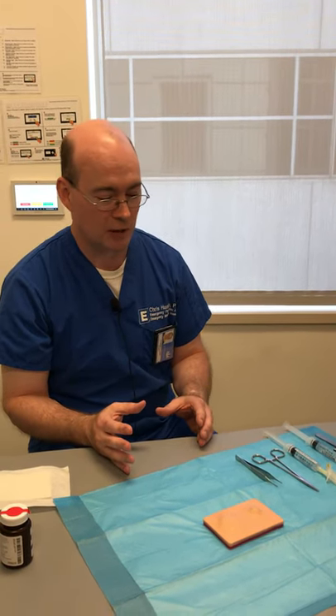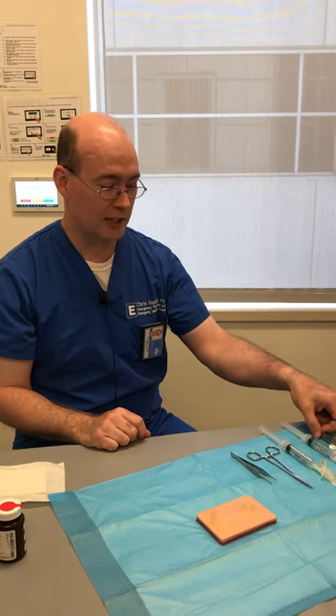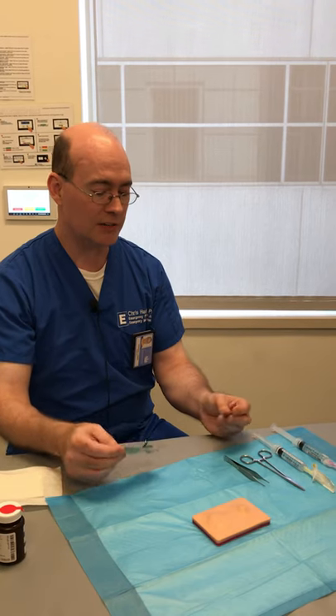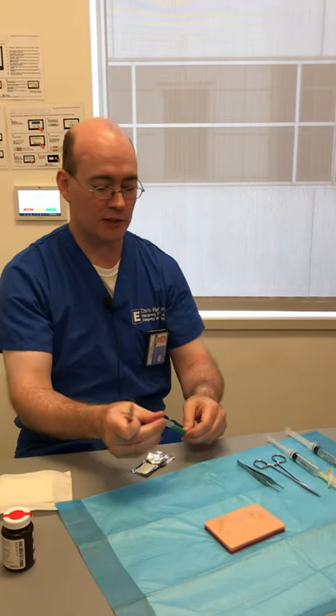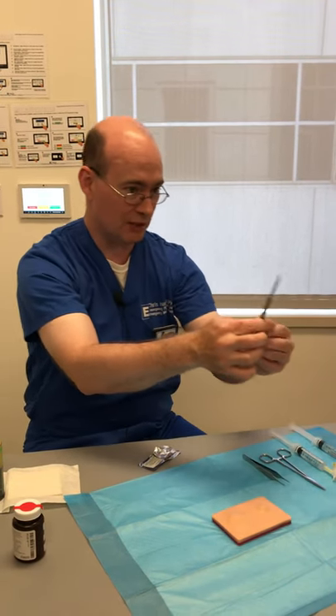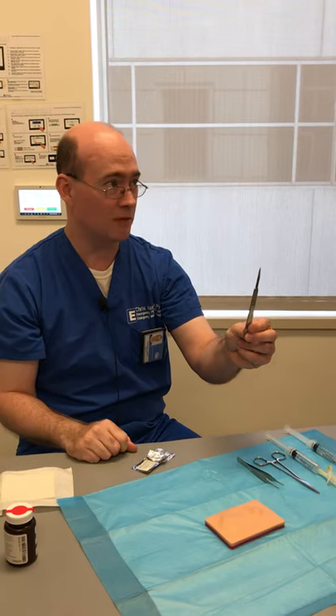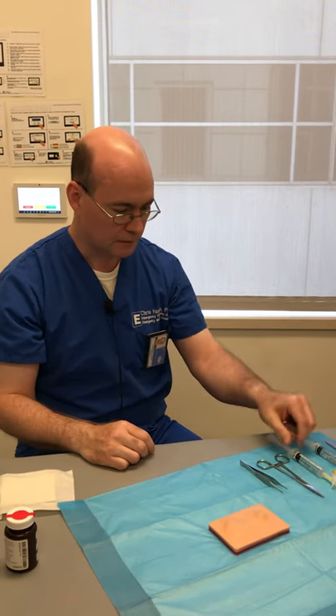Don't call a scalpel a 'scalpel' or you won't be cool in your surgery rotation. The things you'll need are a knife to lance it — there are all different kinds of knife blades. The one you usually want to use for this is an 11 blade, which comes to a point. Other blades are designed for skin incisions during surgery; you need the puncture that the 11 blade provides. There's also another blade with a little hook on it that might work.